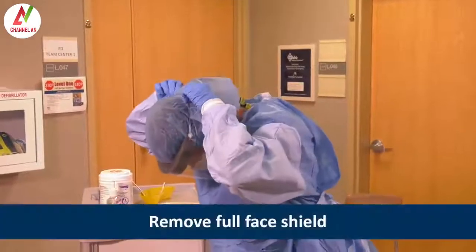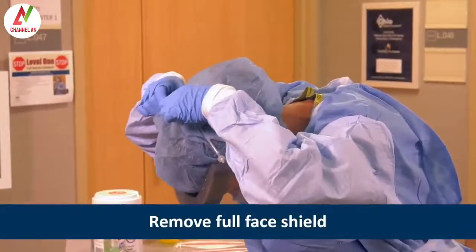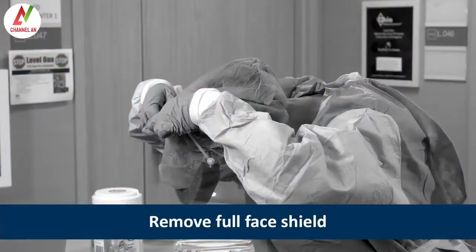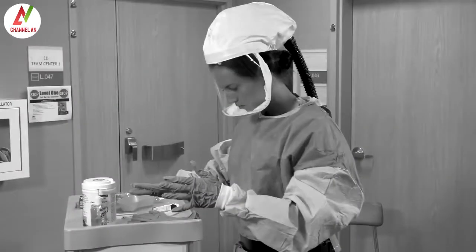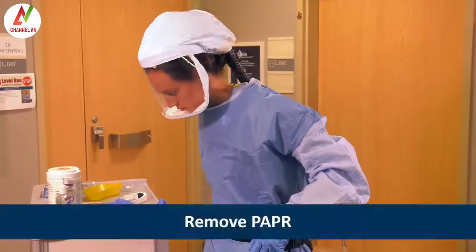Heather removes the full face shield, leaving the surgical mask or N95 respirator on. She tilts her head slightly forward, grasps the rear strap, and pulls it gently over her head, allowing it to fall forward. If Heather was wearing a PAPR with an external belt-mounted blower instead of a respirator and face shield, she would remove it at this time by first removing the PAPR tubing from the hood.